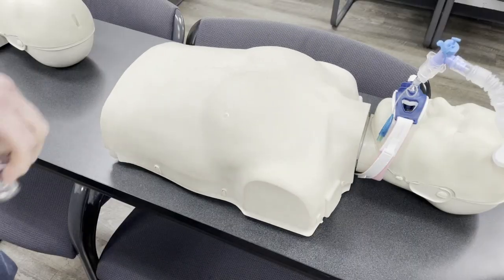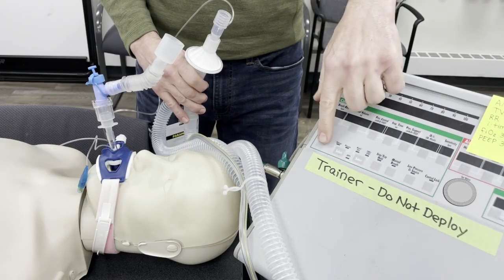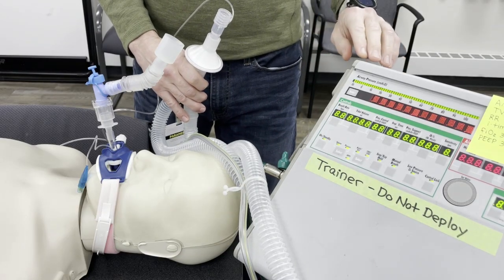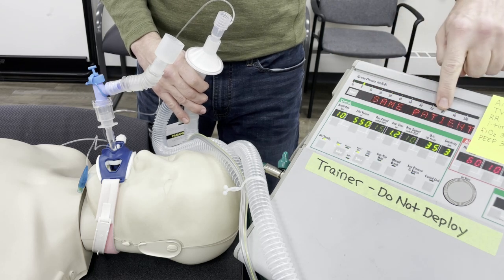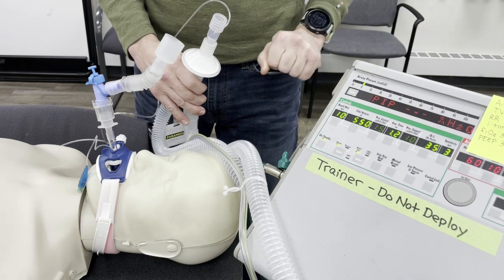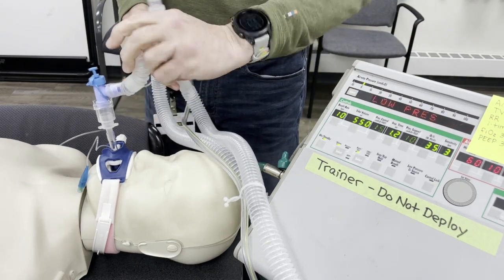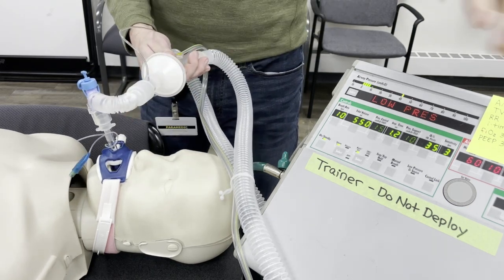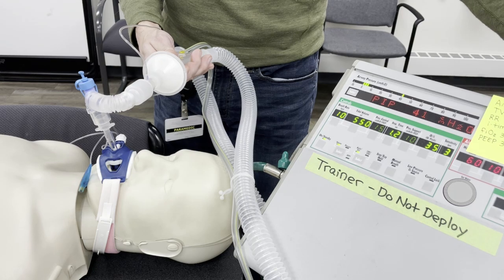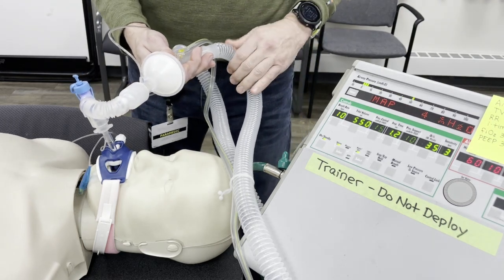With respiratory therapy standing by at the hospital ventilator, power on your LTV ventilator and select same patient. This will immediately trigger it to resume ventilating with the settings you programmed earlier. Your alarm may go off as before — this is normal. Connect the vent circuit to the patient's airway and push the silence reset button twice to clear the alarms and resume normal operation.